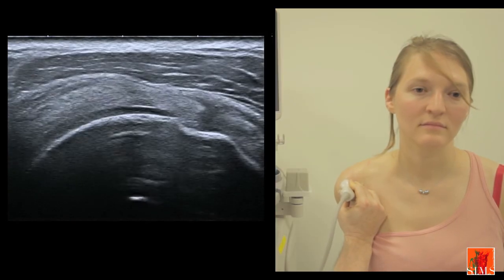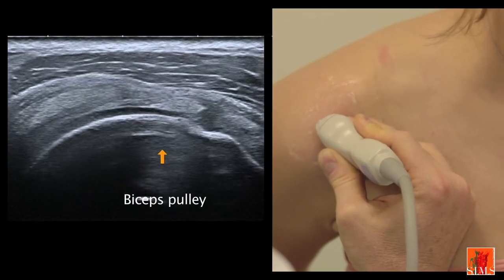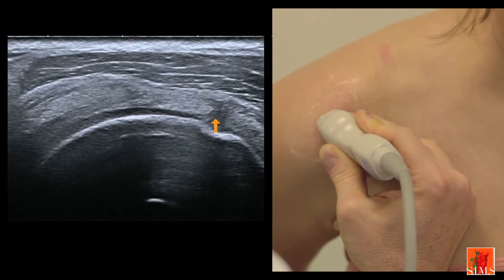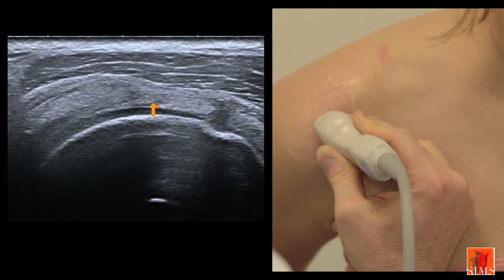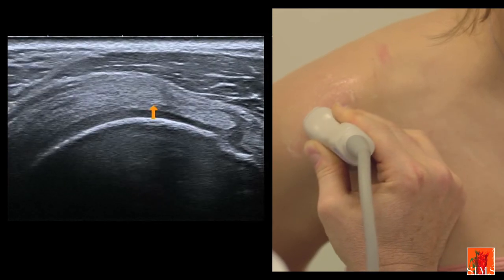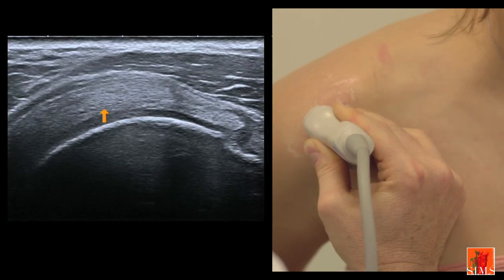Let's continue with the ligamentary components of the rotator cuff interval, with a ligament sling formed here by the superior glenohumeral ligament. Here, by the coracohumeral ligament and its two bundles, this interval extends, as we can guess here thanks to the rotator cuff cable, along the deep aspect of the supraspinatus.